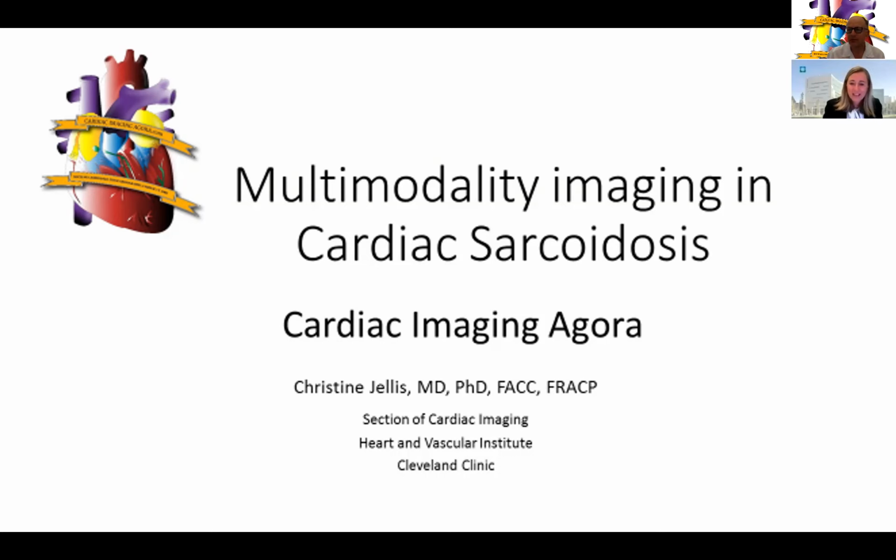Today's talk is going to be on cardiac sarcoidosis, obviously with a focus more on MRI. We're mindful of time, so I'll allude to PET, but that may be a follow-up talk.